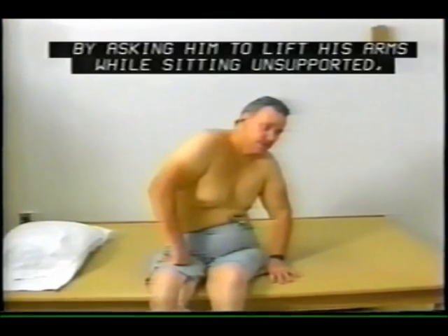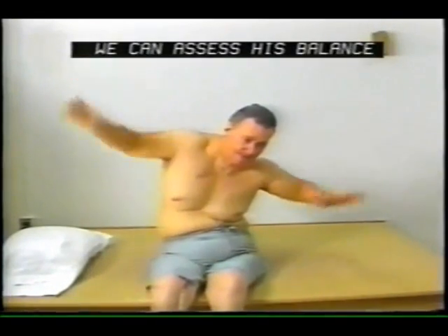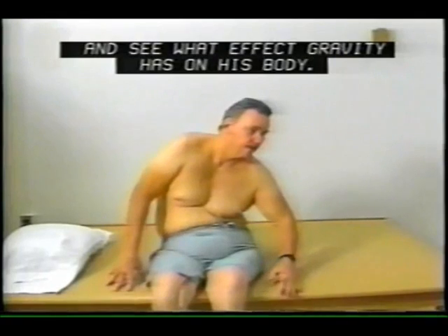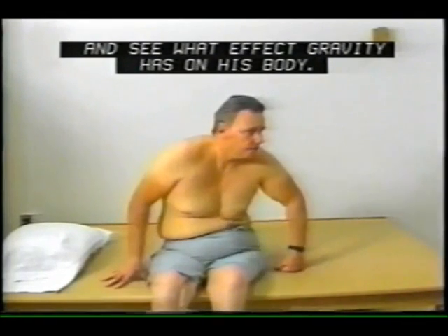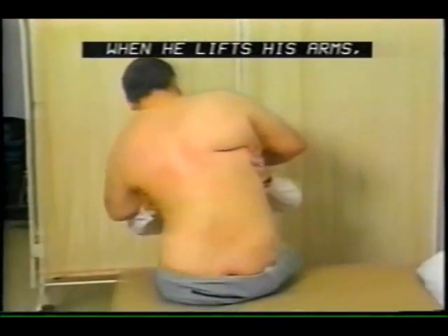We need to look at Steve out of his chair. By asking him to lift his arms while sitting unsupported, we can assess his balance and see what effect gravity has on his body. We can see that Steve relies on his upper extremities for support. When he lifts his arms, his spine collapses and he falls to the right. Not only has he lost his balance and stability, but he also has a functional deformity leading to pain and uneven pressure distribution.